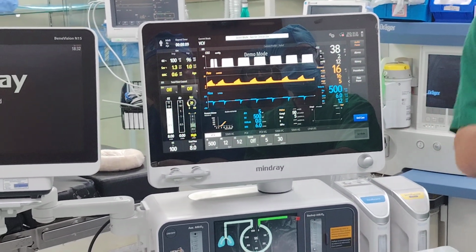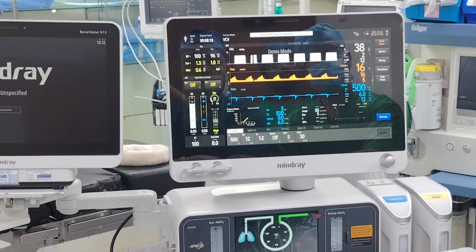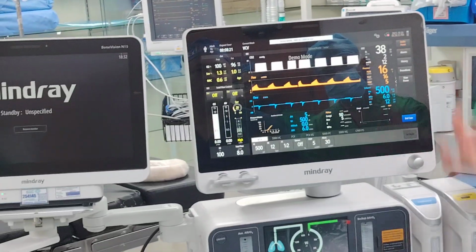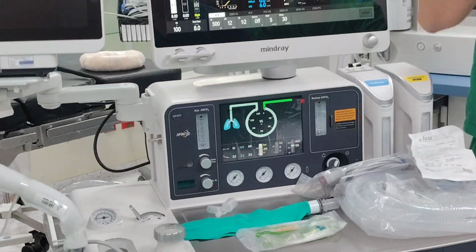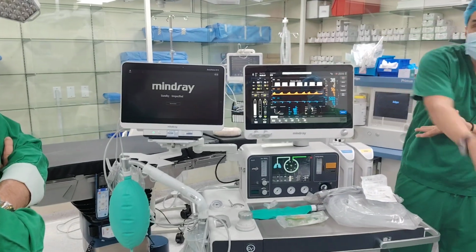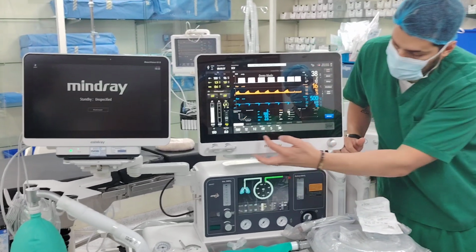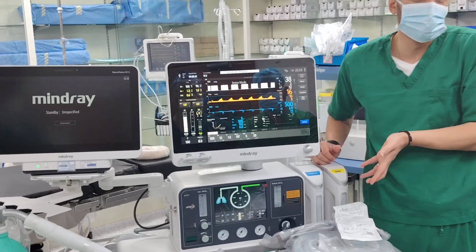Other than that, everyone talks about lung recruitment, but you don't have indicators other than the compliance and the peak pressure. Now you have more of a comprehensive way of looking at it, which is linked to clinical studies. This is the most important thing. So what will you do? You know, today if the compliance is low, very bad, you need high pressure to put the volume inside, right? It's the concept. So what you do, you need to open up the lungs. What you can do is increase PEEP or do lung recruitment. When you do that, these pressures will start to drop.